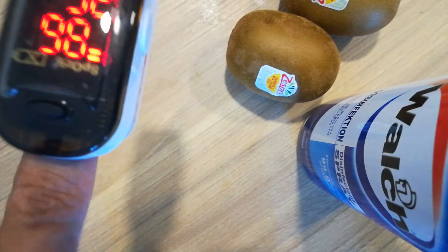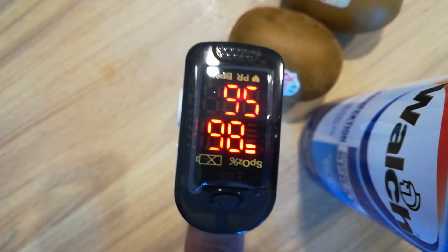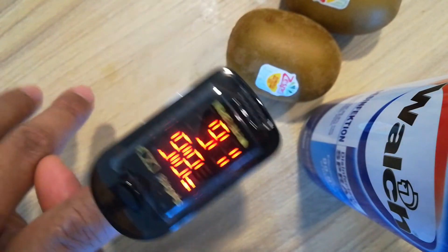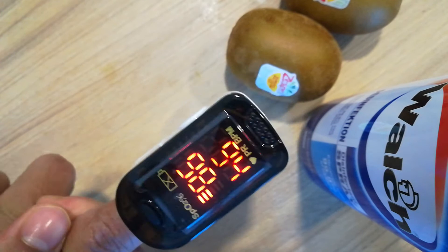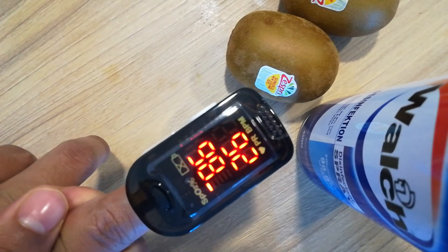So this one you have to watch like this — 98, 95 — going down slowly. This will come down to 77, 75, 78 like that.